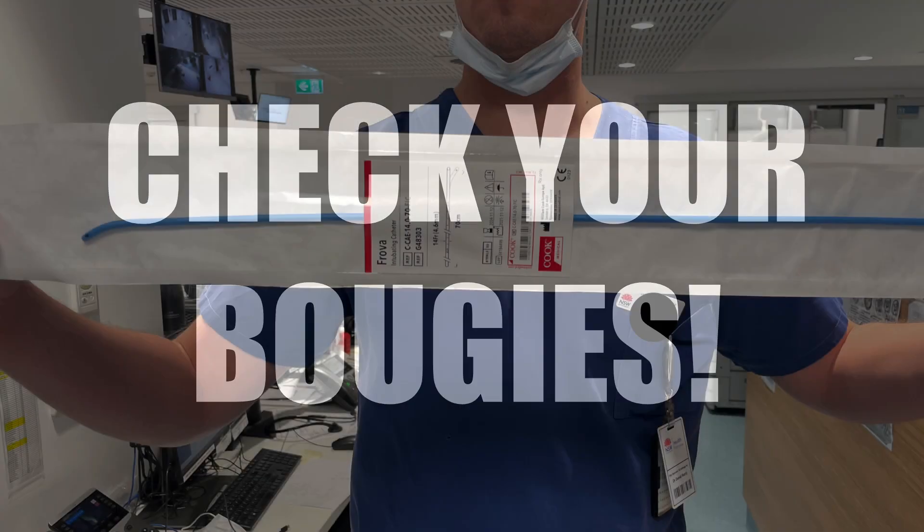Many of us like to use bougies when we're intubating patients, but please be aware there are many different types that can look similar and they are not all the same in terms of performance.